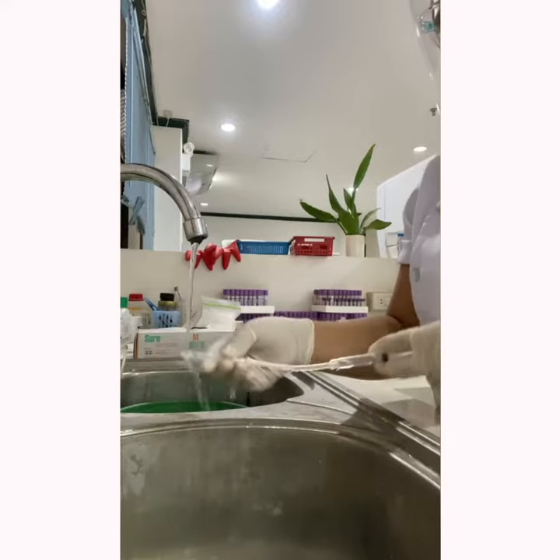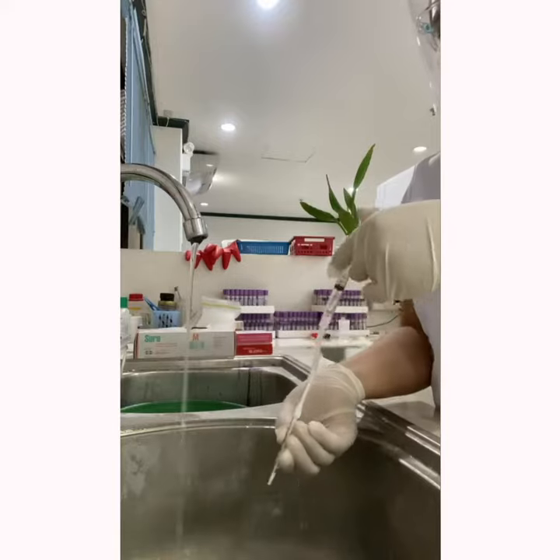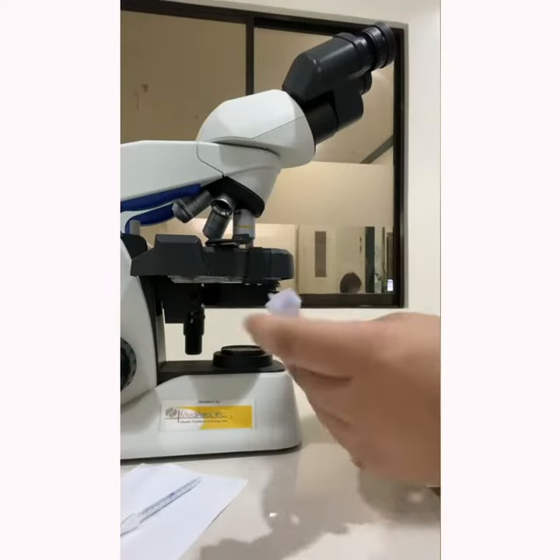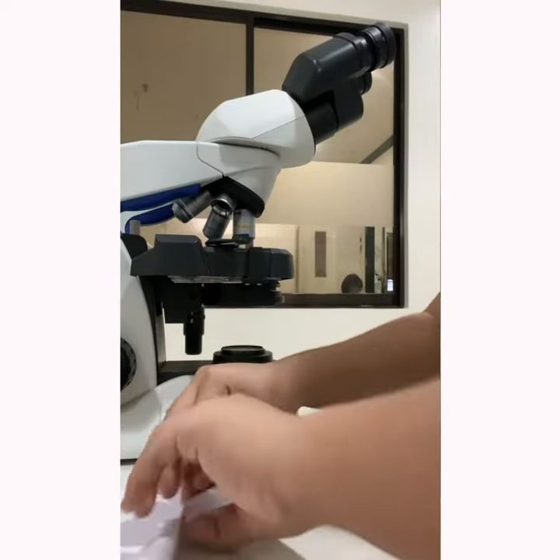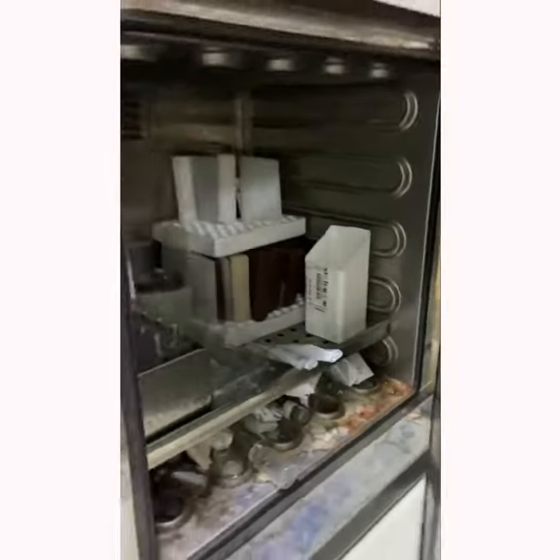After analysis, immediately clean the WBC pipette, tube, and plunger. Wrap the WBC pipette in a paper to be placed inside the oven for 5 to 10 minutes for it to be dried quickly.